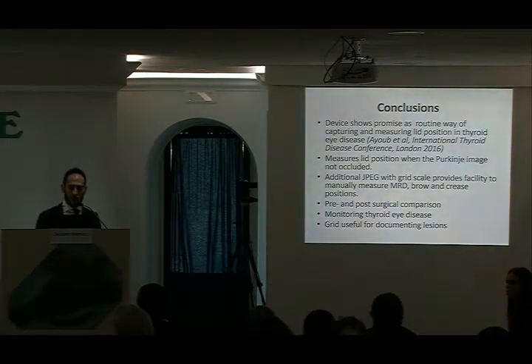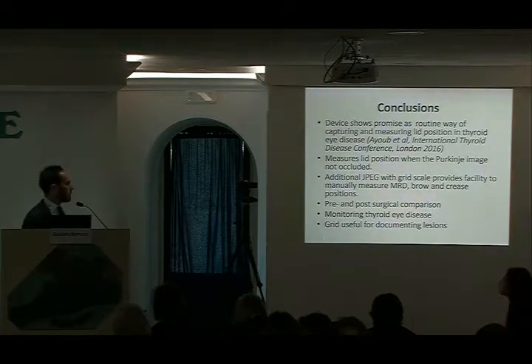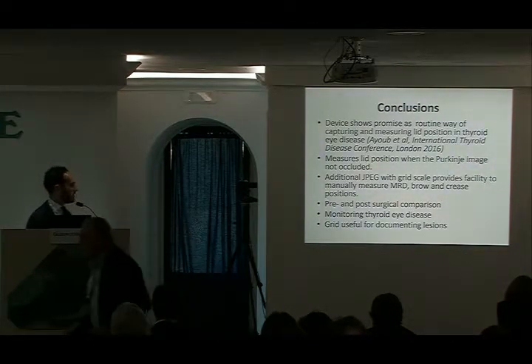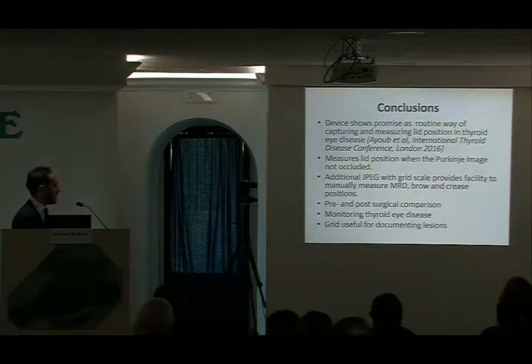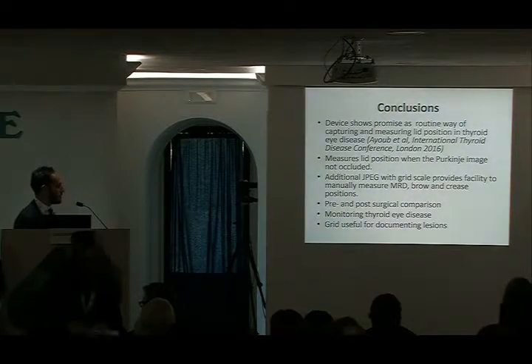Photographs can also elucidate abnormalities of the eye structures more clearly than charts, notes, or drawings. All the information that we collect can be very important in a pre- and post-surgical comparison and can be used to identify changes in patient conditions over time. As I said, all the information plus the high-resolution grid and the photographs can also be very useful for documenting lesions.